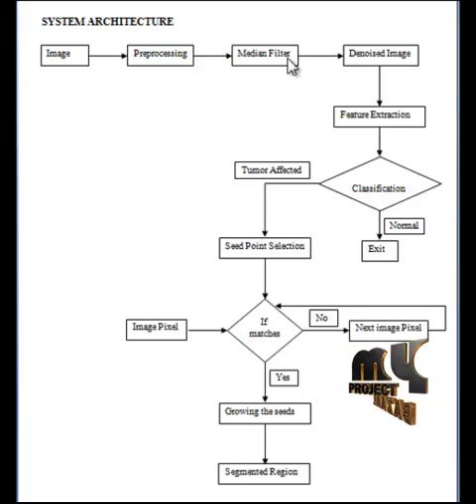Then we move on to the classification process. Initially, the features were extracted from the pre-processed images. The features from the chosen region of interest are extracted for further processing. Shape features such as area, extent, orientation, and solidity were essential in order to get better classification results. We extract texture features. The texture features are extracted according to the statistics of the gray level co-occurrence matrix.